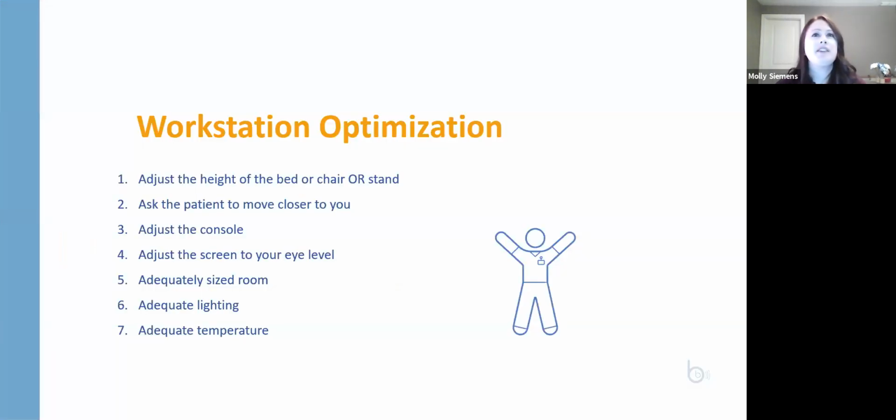So here is a checklist that I use prior to every patient I perform. And it probably seems a little repetitive to go through all of these steps for every patient all throughout the day, but every patient scenario is different. And using these little steps can be the start of healthy scanning habits.